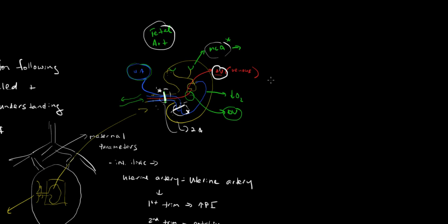And the student of medicine is somewhat familiar with venous waveforms because we're taught to take jugular venous pressures within patients, and there's an A wave and an X descent, and I won't get into it in much detail, but to my understanding, that's really a pressure curve. And if you're doing invasive monitoring in the ICU, you may be looking at a pressure curve. But what the sonographer is looking at here is a flow curve, but it's not too dissimilar.